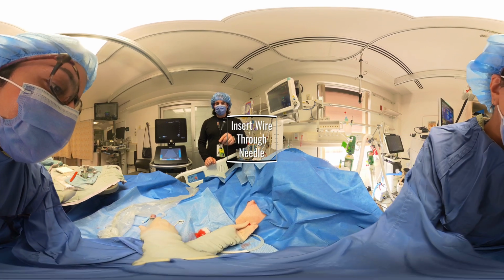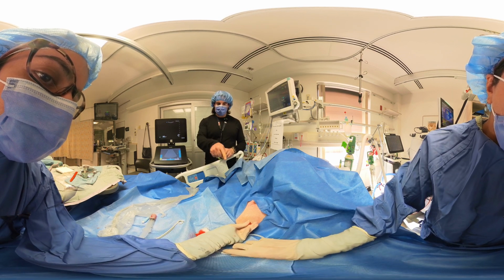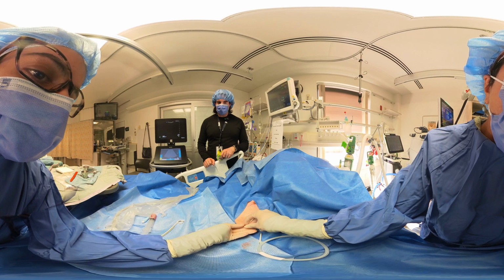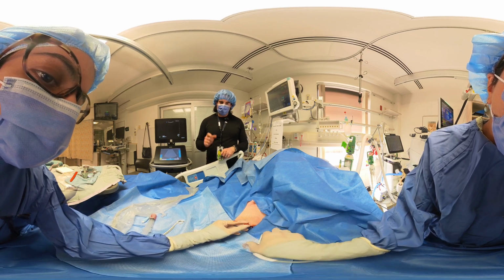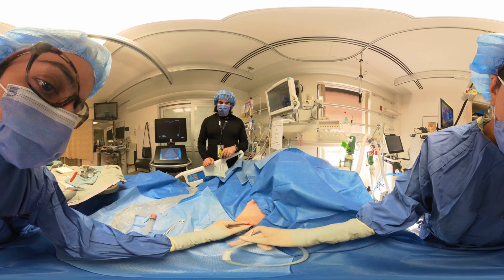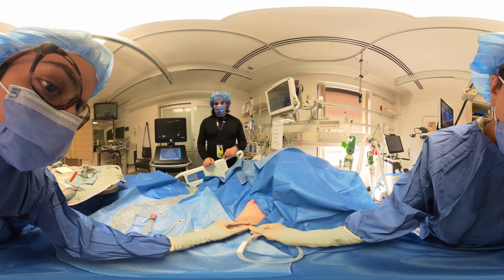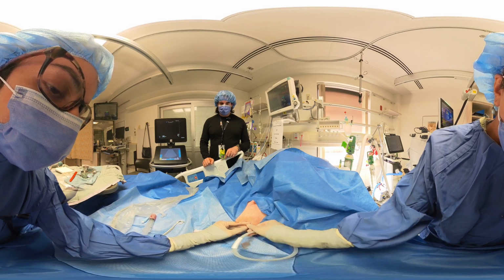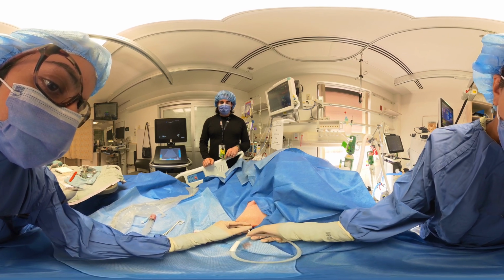Okay, now we're going to cover the end of the needle so we don't entrain air for now. Okay, and then we're going to pass the wire. Yeah, you can use that straightener. Yeah, exactly. So let's pass the wire here.